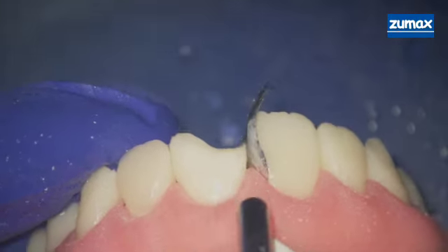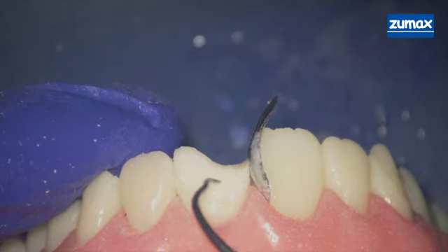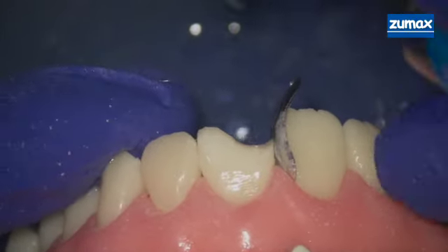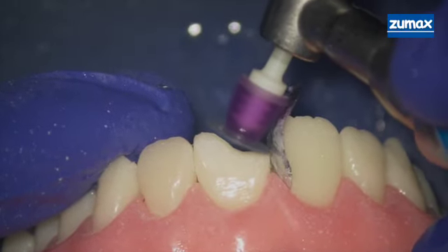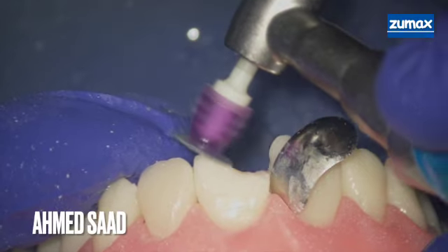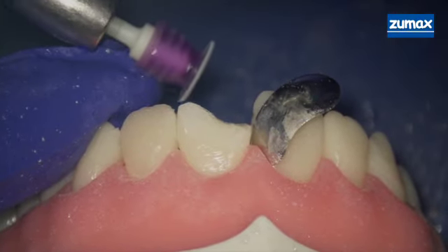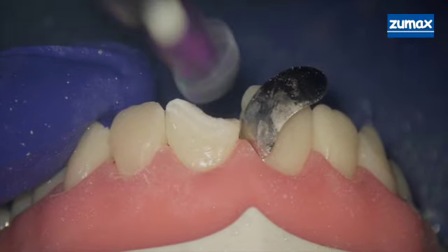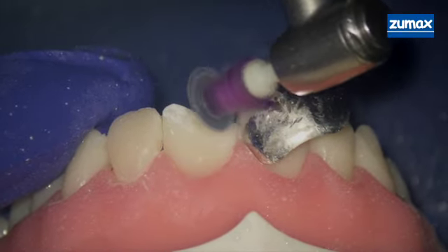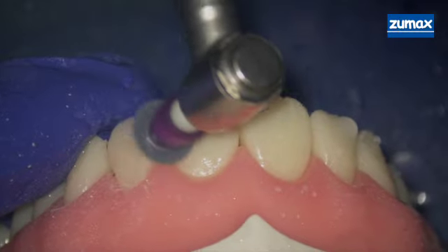After finishing the functional bevel, we start using a disk for the aesthetic one. I prefer to use a coarse disk to remove any sharp angles and smooth the preparation. The aesthetic bevel means removing only 1 to 2 millimeters as a scratch from the labial surface over the functional bevel — just for smoothing and rounding the preparation. Any sharp angle underneath the restoration will create an abrupt optical transition; our aim is to make a softer optical transition to avoid any line of demarcation. This is what we call the infinity margin.